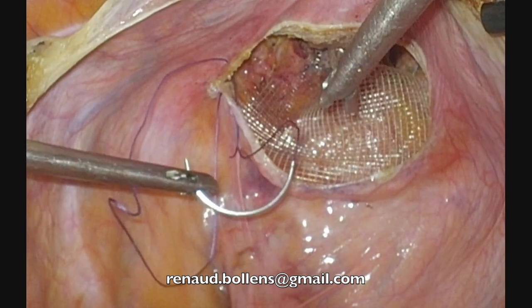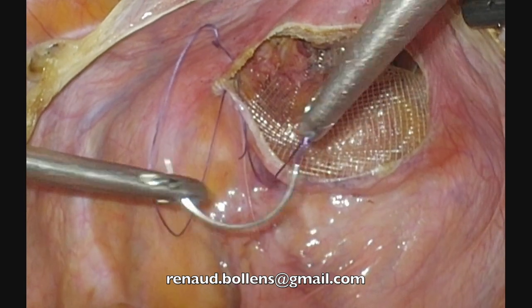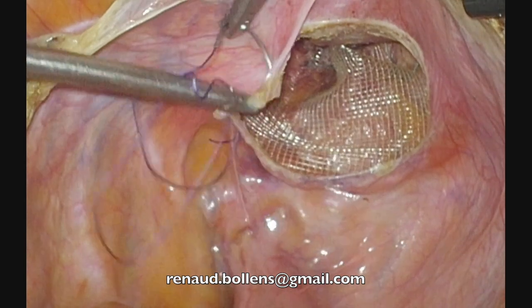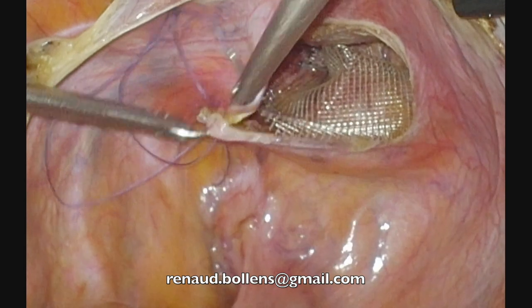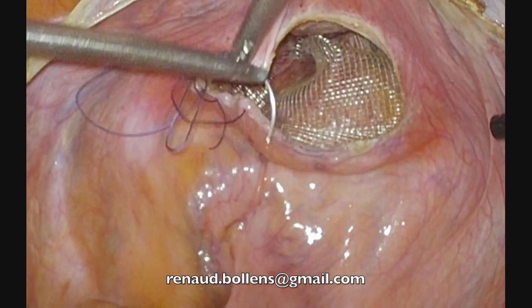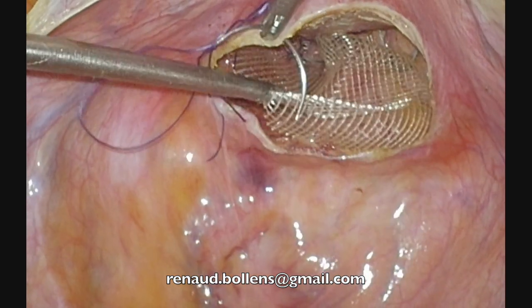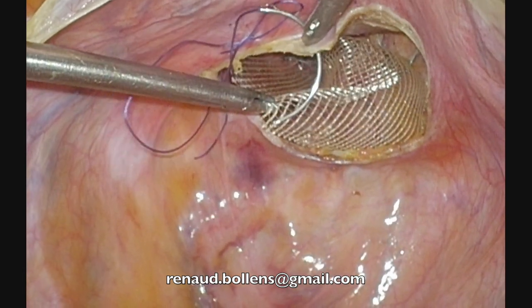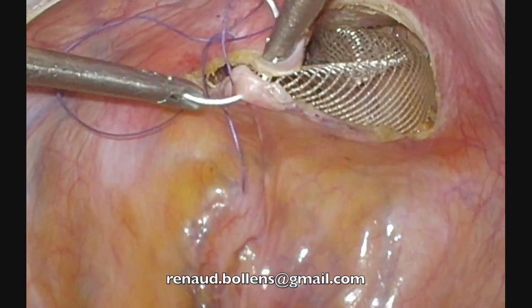Nice. Another basic technique here. When you are passing the first passage, you directly replace the needle in the good position. I don't pull completely on my running suture for the moment because it's time consuming. And I just pass three or four times. I replace my needle, I re-catch directly, I repass. Now I can catch the tail of my mesh, the tail here on the place where it's not so wide, just the edge to block in the closure of the peritoneum.